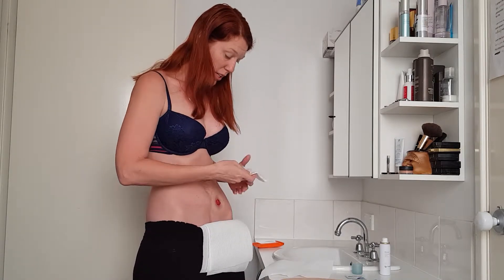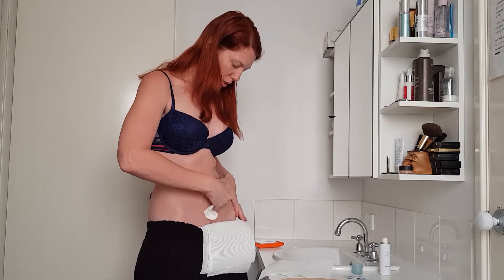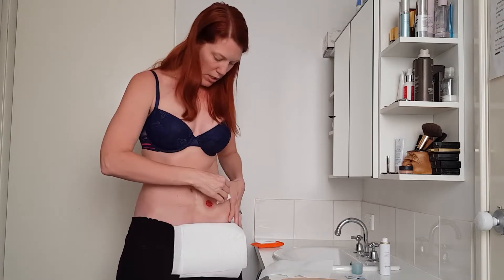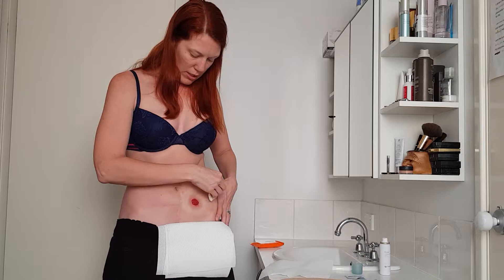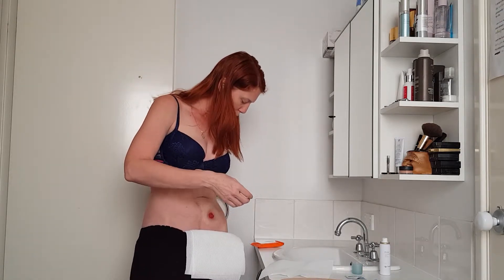So I'm interested to see how the aloe vera one actually works. This is Squish, by the way — it's my stoma. He's sticking out here at the moment because I have a convex base on all the time. He's pretty flat otherwise.